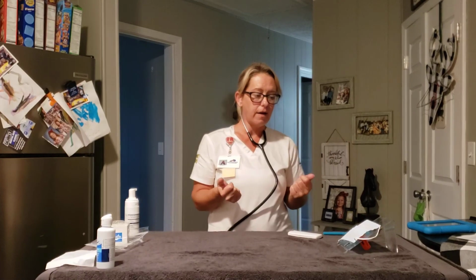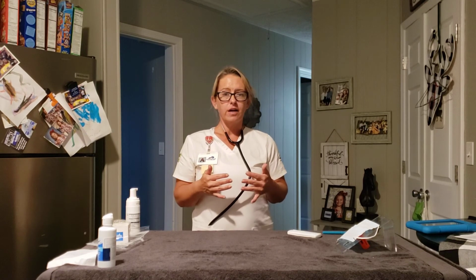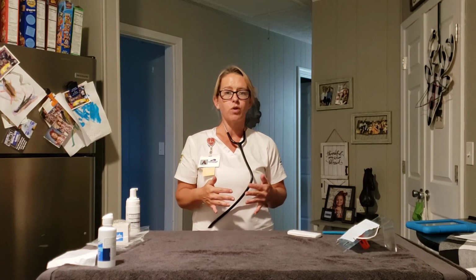And then I am going to document that the patient tolerated the trach suctioning well, that I saw a little mild yellow scant secretions, and that her chest sounds began with a wet, frothy sound, that they were clear upon auscultation after the second attempt of suctioning. Thank you.